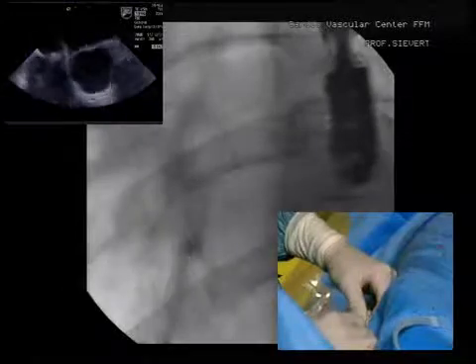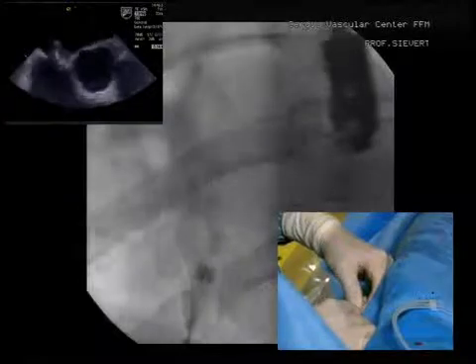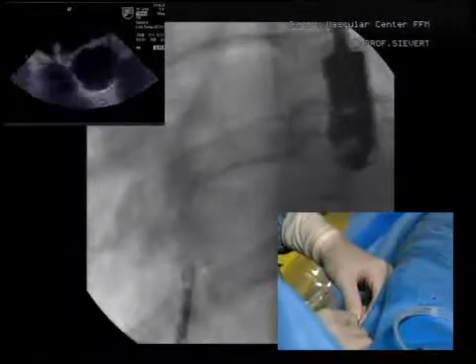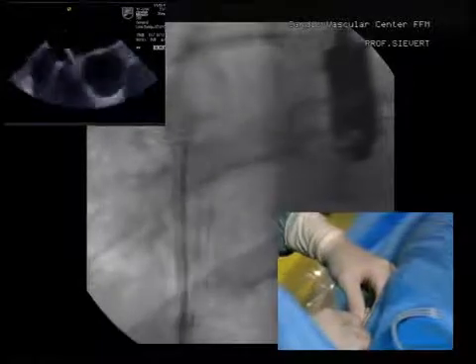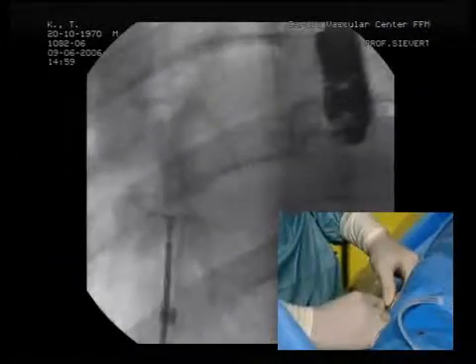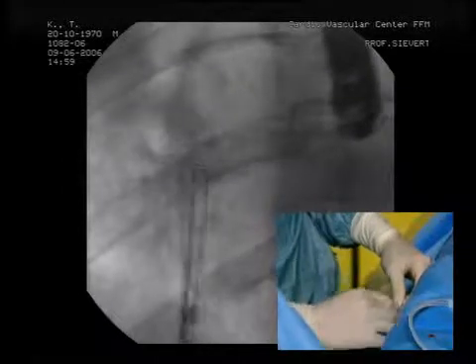Now I will release the right atrial disc. I'll put back the sheath. Okay, now it's implanted. As you can see, we check it — we push it forward and backwards. You see here.